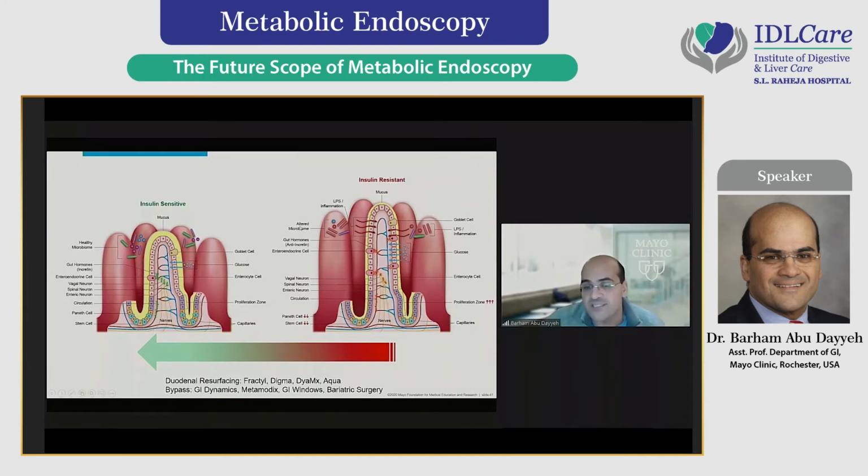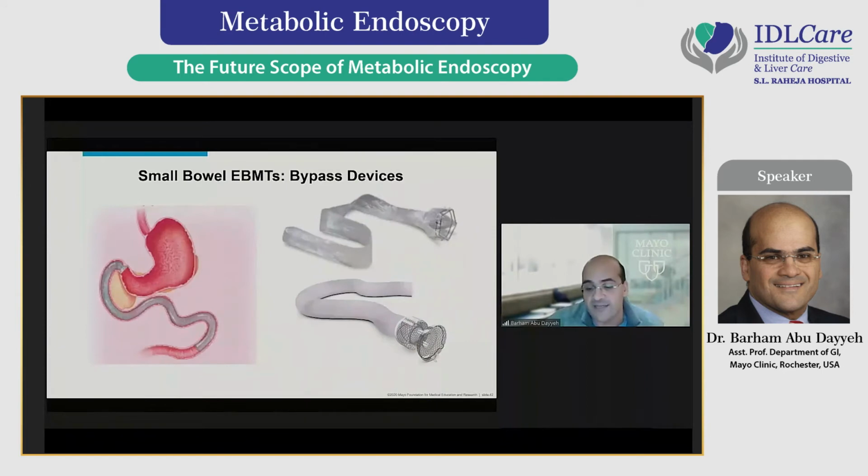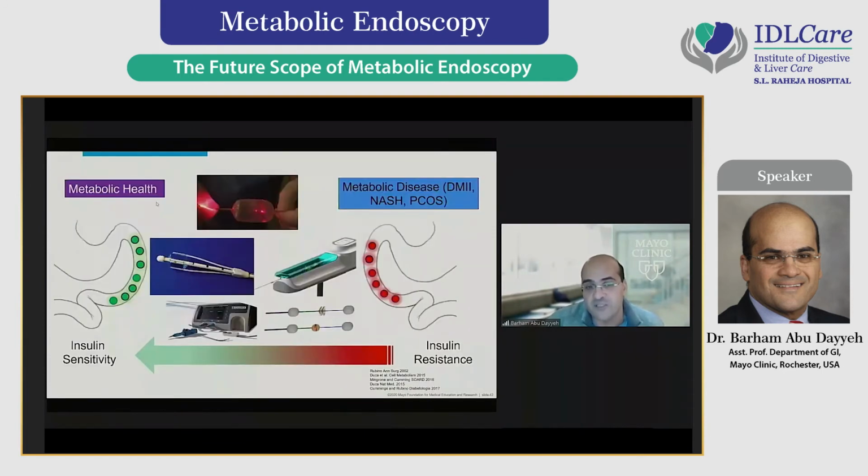So the question is, could we take this insulin-resistant state of duodenum and reset the metabolic clock to make it metabolically healthy and orchestrate a robust metabolic response? This has been the target of these barrier devices, but more recently, this has been the target of ablative techniques that could either use laser, heated water, or now athermal methods through the pulse electrical field in order to ablate the duodenum for metabolic benefit, just like we do with Barrett's esophagus, but now in the duodenum.